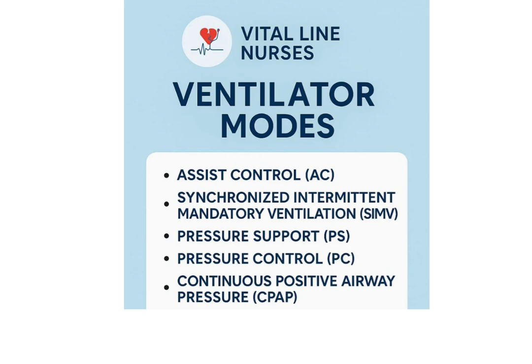2. SIMV, synchronized intermittent mandatory ventilation. Next is SIMV mode. Here, the ventilator gives a set number of breaths, but the patient can also take their own breaths between them. It's a good mode when starting to wean a patient off the ventilator.